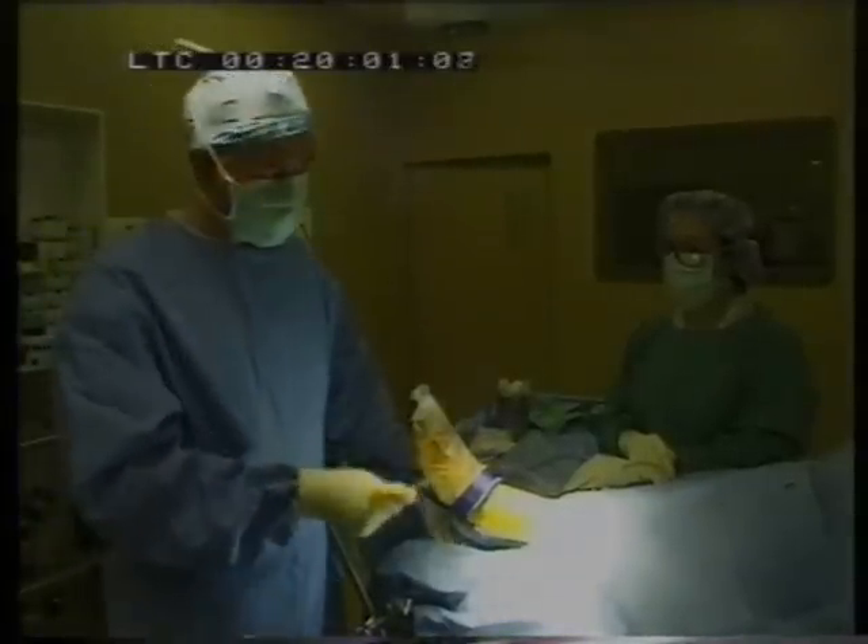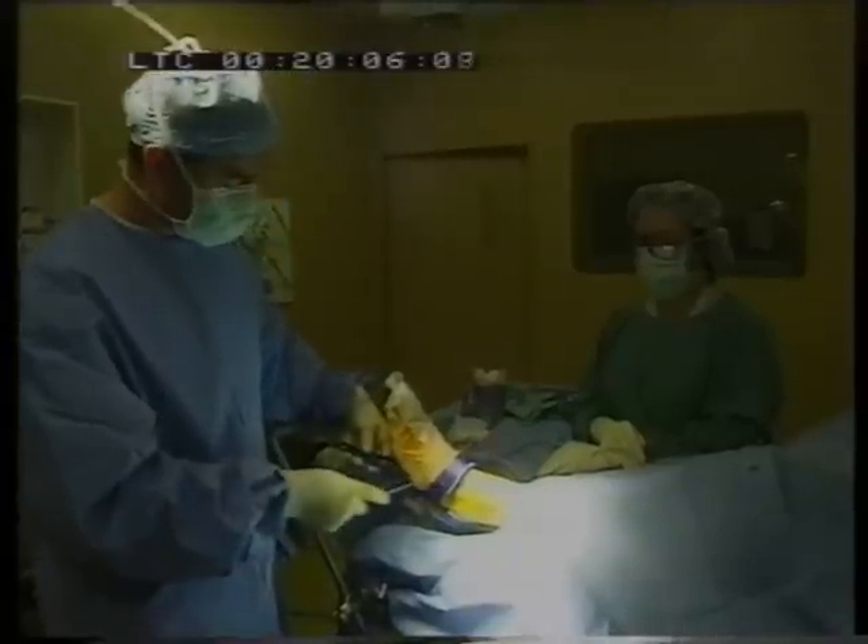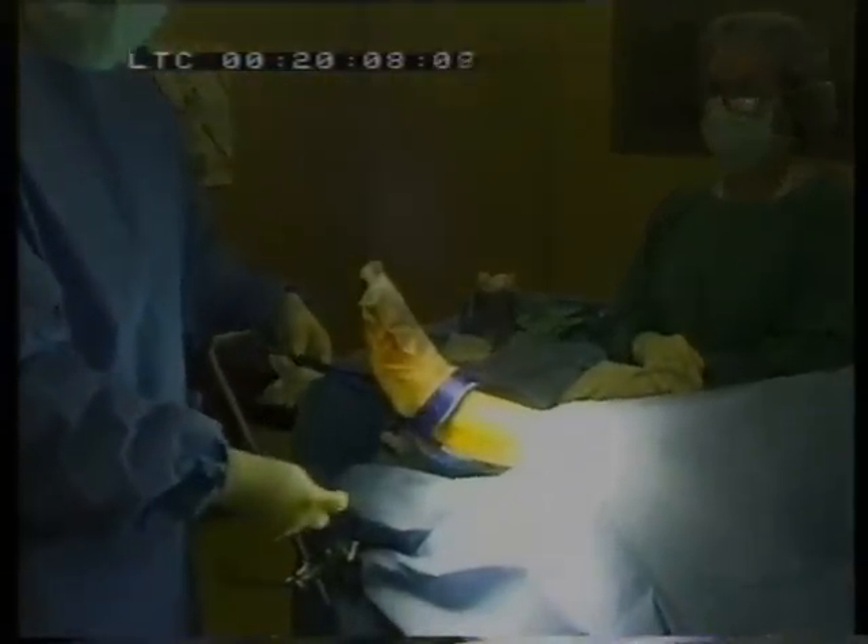This is a setup that we use. We put an impermeable drape over the ankle and we use this non-invasive distractor. You'll notice that the distractor sits outside the drape, so you can even reapply it during the course of the procedure if you need to.